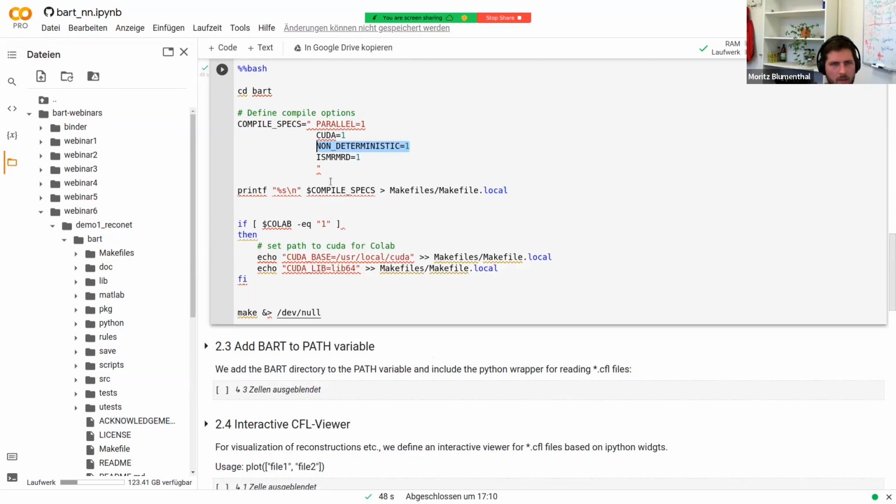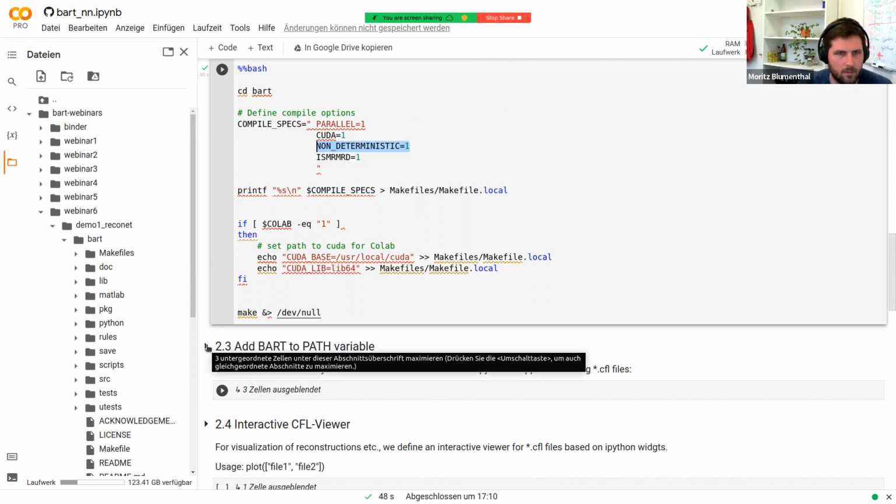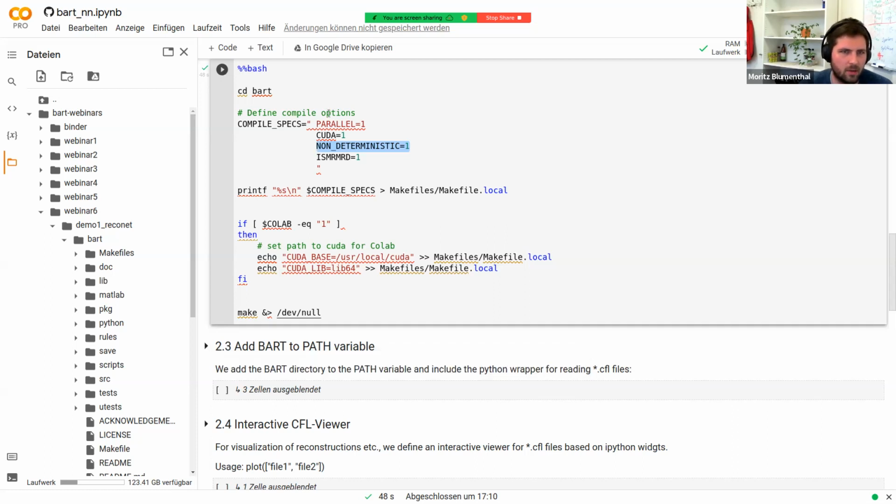The order doesn't make it less accurate, but it just makes it less deterministic if it arbitrarily orders the operations. So it's a long-term aim to get fully deterministic results for everything in BART, but this flag only addresses some part of the problem space. Let's say it like this. For certain stuff, you get deterministic results if you set it to 0 at the cost of some performance. Yes. But that's also only related to GPU algorithms.